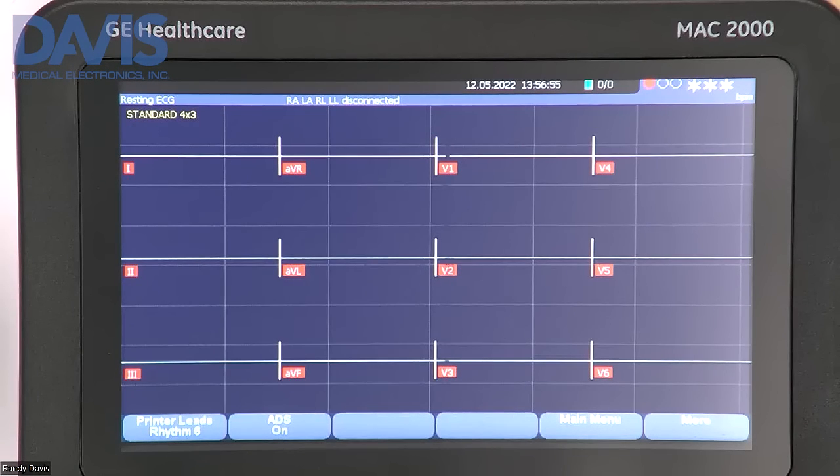On the display screen you will see your ECG type, your ECG printout format, your date and time, battery status indicator, and your hookup advisor indicator. This tells you the quality of your ECG.